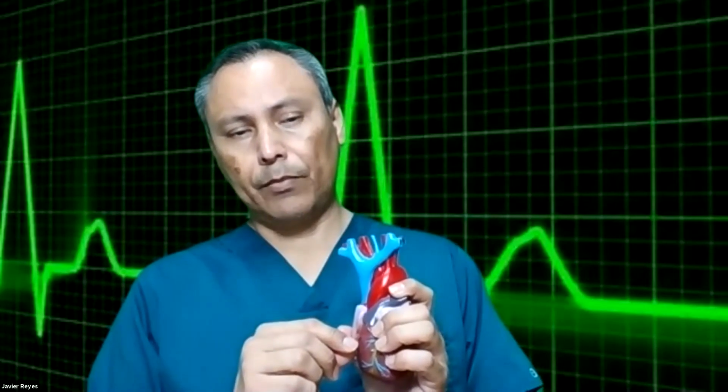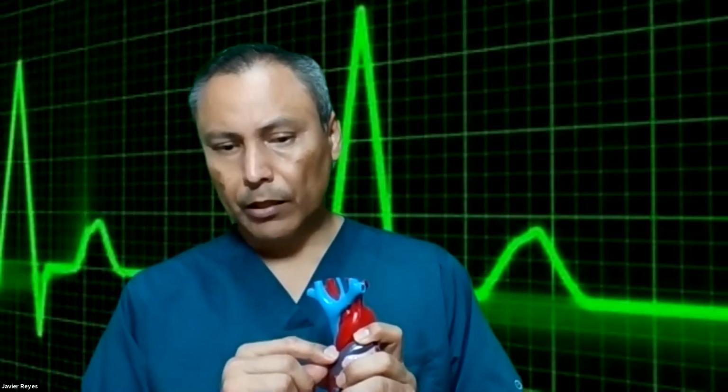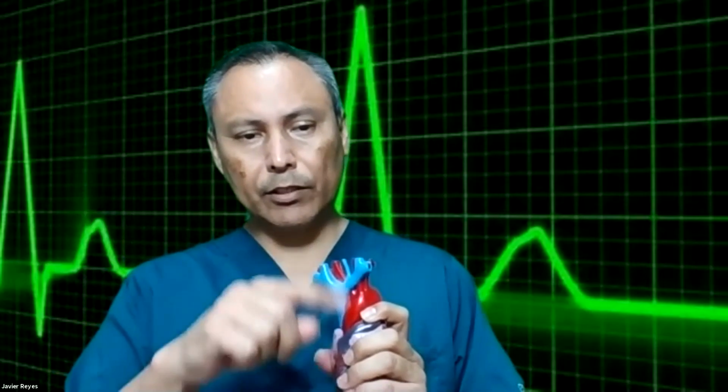The PR interval is where we have a problem. The PR interval goes beyond the 5 little squares, 0.20. That is the first degree AV block. The PR interval is longer. But other than that, it's going to be the same. Just the PR interval, highlight it, make it a star, whatever you want. That is going to be the main problem with first degree AV blocks. The QRS should not be affected. Once the signal makes it through the AV node to the ventricles, the QRS should look completely normal.